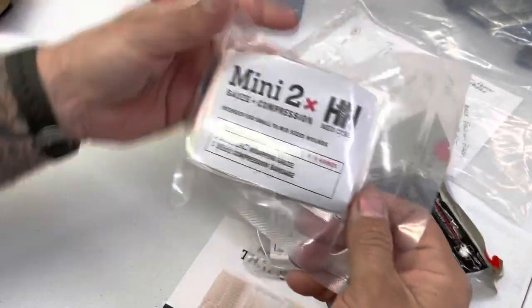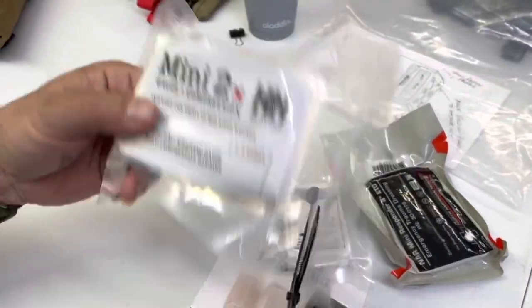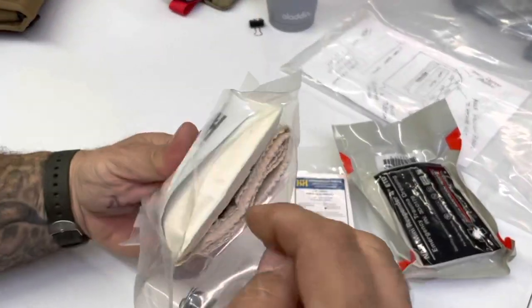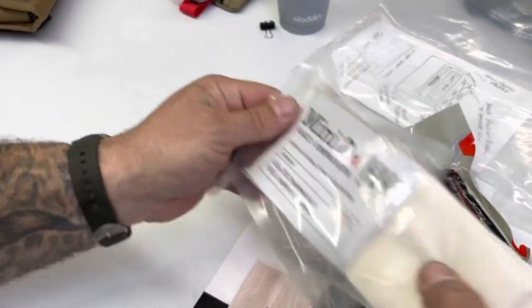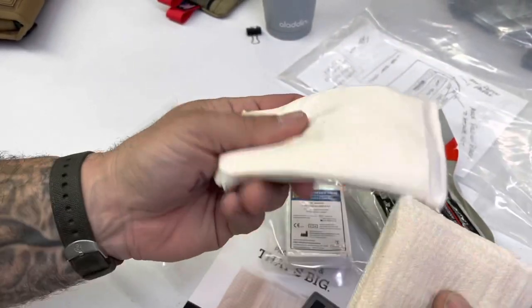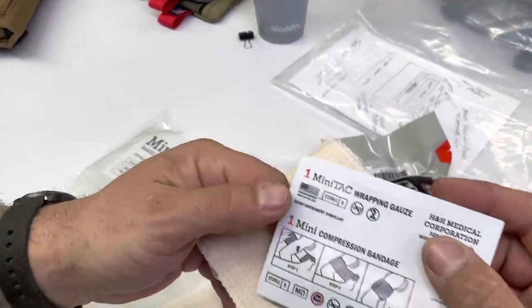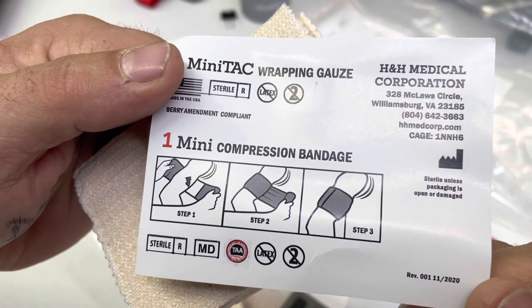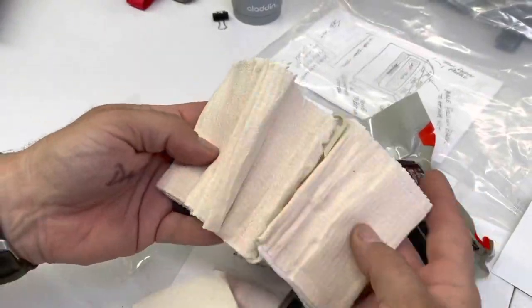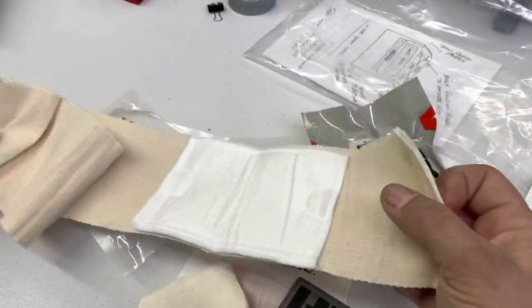Let's tear this apart and see what we're dealing with. This is the H&H Mini 2x - vacuum sealed. You pop it open like so. This is linen - that's a nice gauze pad right there, for covering the wound, not packing the wound. Here are the instructions: step one, step two, step three. So this is essentially a mini ETD.